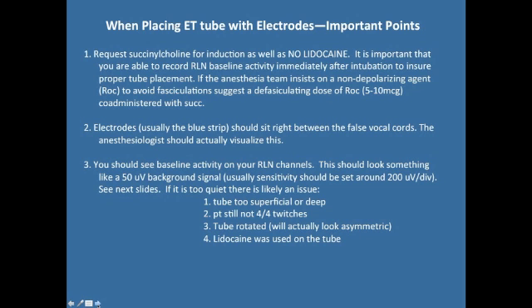If you don't see activity, you either have a misplaced tube or electrode, excuse me, or you have muscle relaxant on board. And so we need to get rid of that one variable, that muscle relaxant. So we ask them to use SUX.